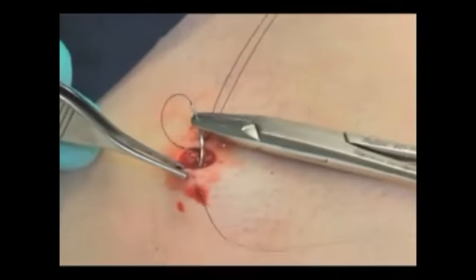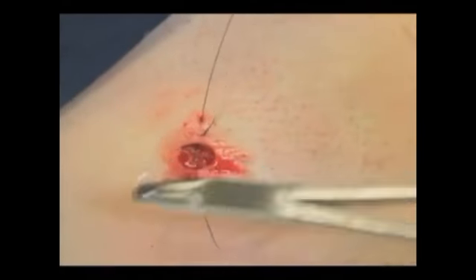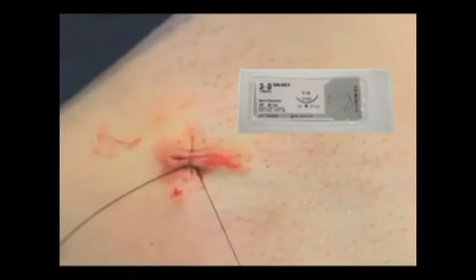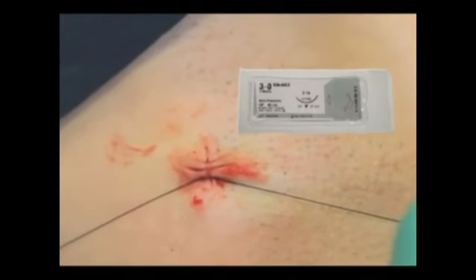On volar skin, the suture material may cut through the tissue, so bites further away from the punch defect are needed. Also, a 3/0 nylon suture will be less likely to cut through tissue than smaller caliber sutures.